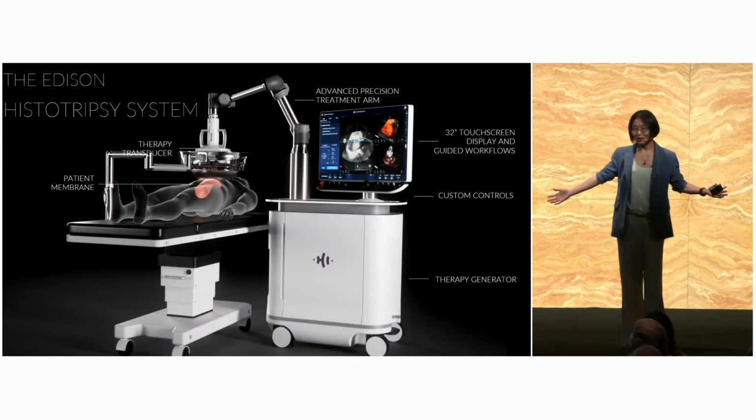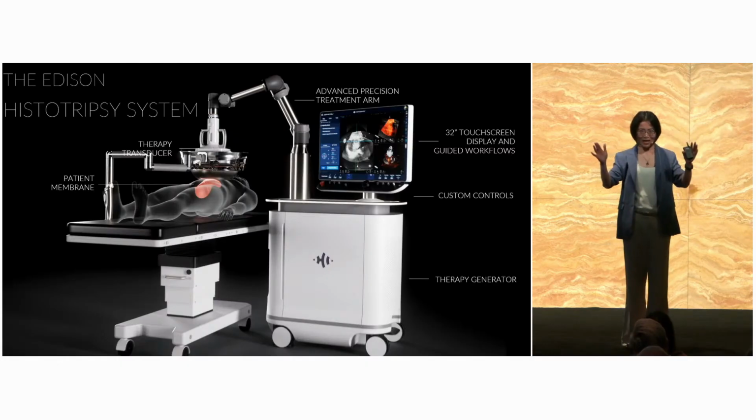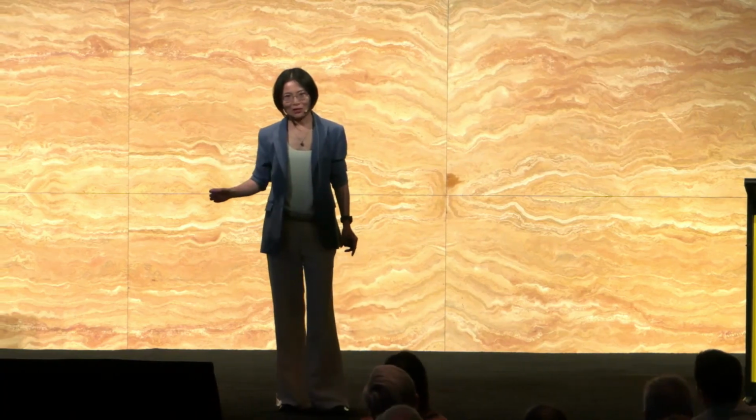It's another 60 years. The time is right now that the whole movement of medicine is moving towards minimally invasive, non-invasive. And it's my belief that the next era of medicine is entirely non-invasive surgery. And it's starting from histotripsy. And not just liver tumors, renal tumors, and pancreatic tumors. We're looking at different targets also, from breast tumors, prostate tumors, thyroid tumors, anything you think of.